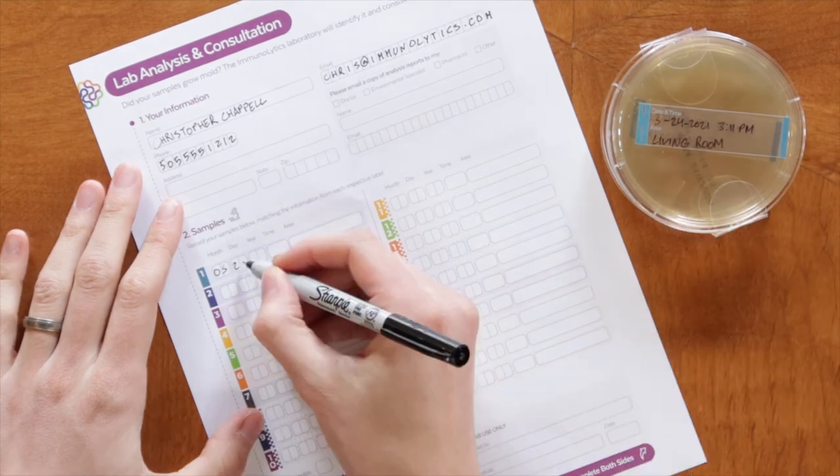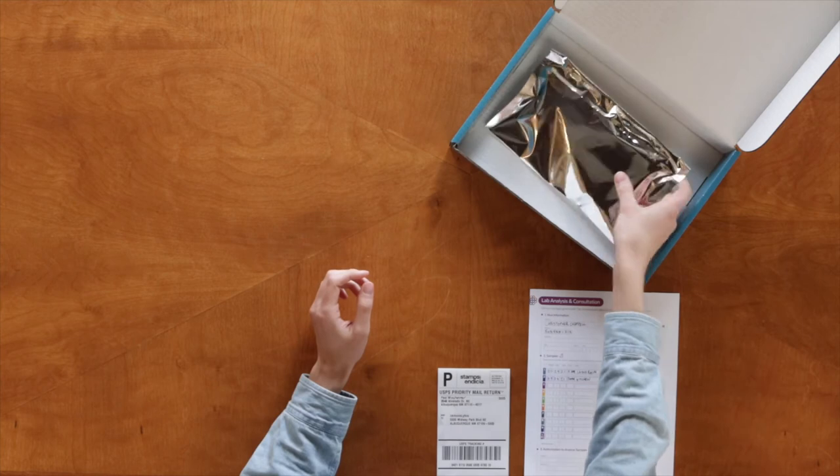First, ensure the lab processing form is completed fully and each sample on the form matches each sample label. Then place your samples in the foil envelope. Then place the foil envelope and your mold testing form into the mold testing kit box together with some appropriate packing materials and then affix the prepaid envelope or ship it yourself to the Immunolytics lab.